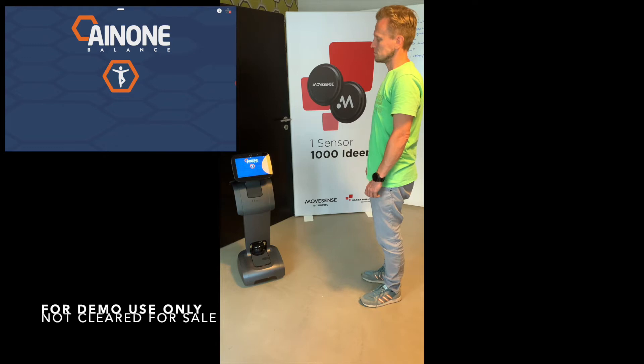Hi, Nico. I am sent by Andy, your physiotherapist, to make a balance measurement with you.